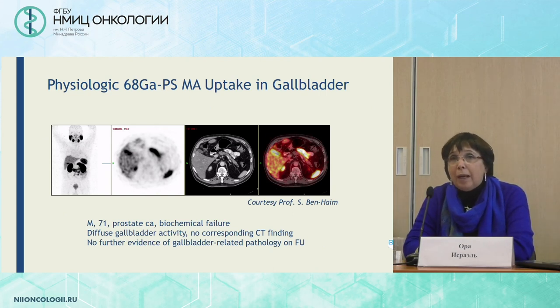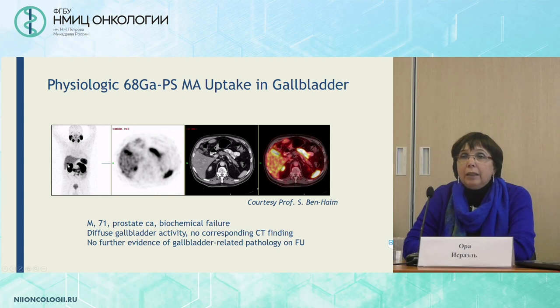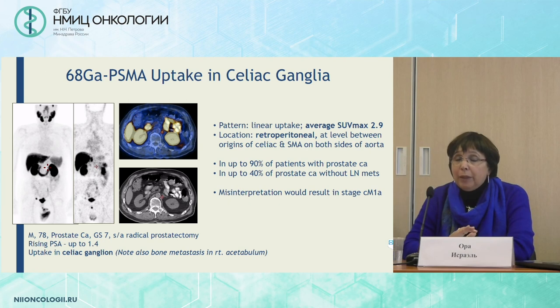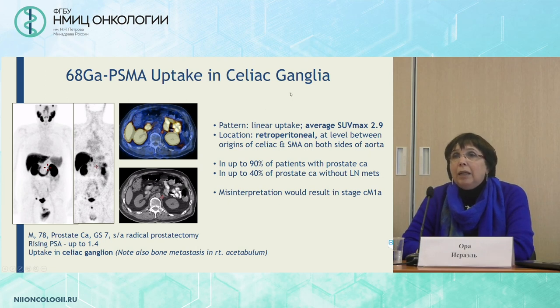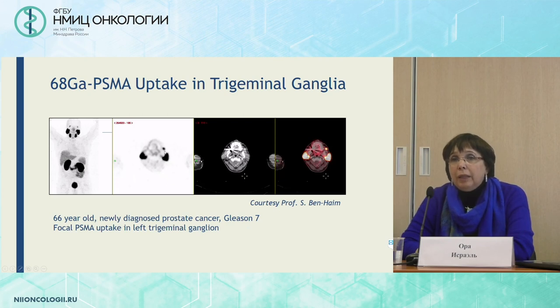These are some examples of physiologic PSMA uptake. This one is in a patient who had biochemical failure — uptake was seen in the gallbladder with no further gallbladder-related pathology. This is something largely discussed mainly in case reports. Uptake in sympathetic ganglia: this is uptake in the celiac ganglia, this is uptake in the stellate ganglia in the cervical-thoracic location, and this is uptake in a trigeminal ganglia.